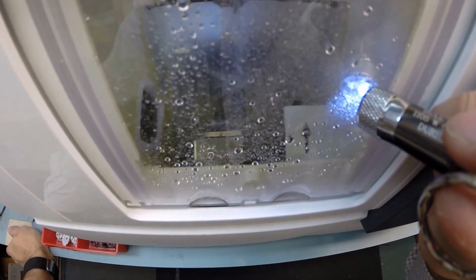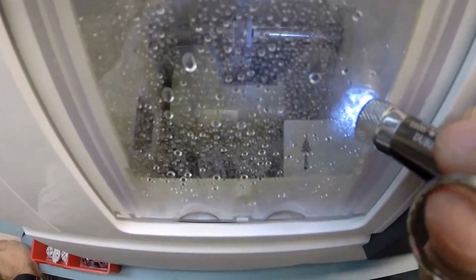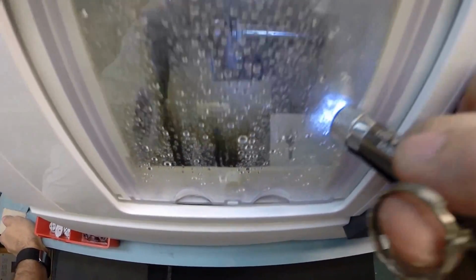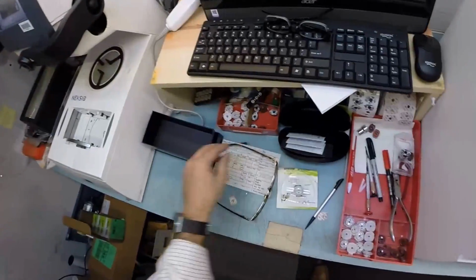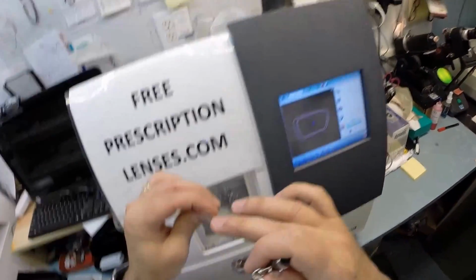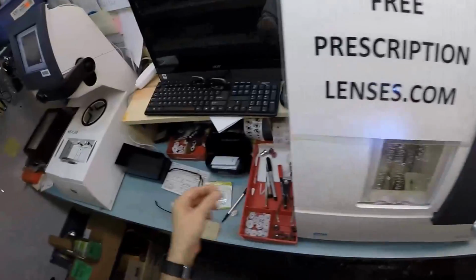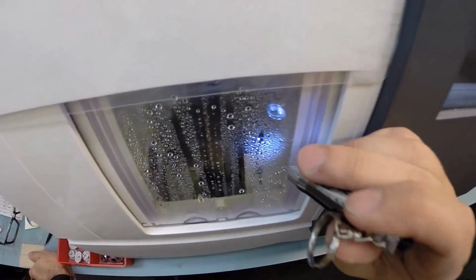Now in just a moment, an arm with a lever on it and with a little cutting wheel that looks like it should be on a Dremel tool. That's what's going to put the safety bevel on the back surface of the lens. Where's one of your demo lenses? What'd I do with it? Here it is. The lens is the final shape, but it's just going to smooth out any rough edges that may be on the back surface of the lens that if it was to protrude outside the frame could come in contact with the face, so I'm going to smooth that off.